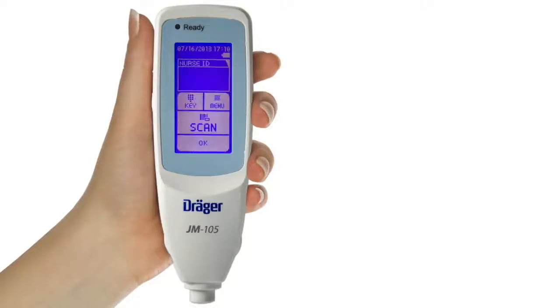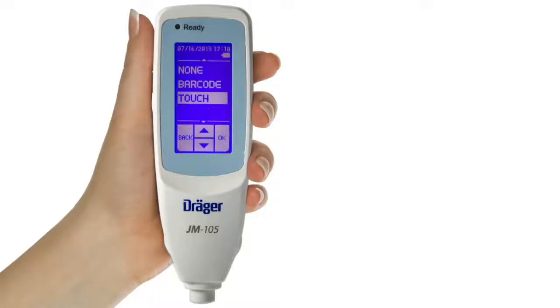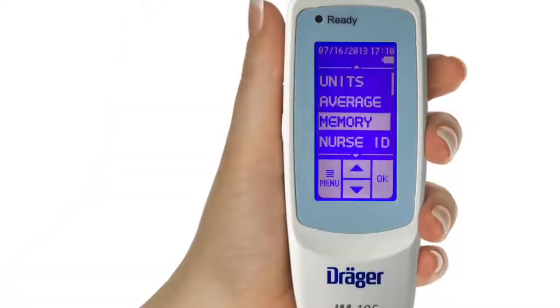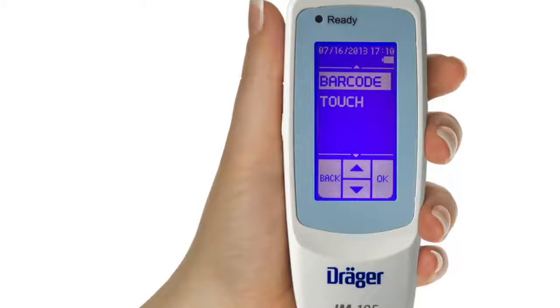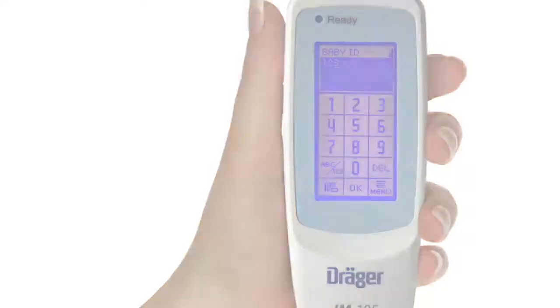If you select Barcode, you will scan in the nurse's ID. If you select Touch, you will enter the nurse's ID on an alphanumeric keypad. The next menu item is Baby ID. From the configuration screen, highlight Baby ID. You have a choice between Barcode and Touch. As with Nurse ID, if you select Barcode, you will scan the baby's armband. If you select Touch, you will enter the baby's ID on the alphanumeric keypad.